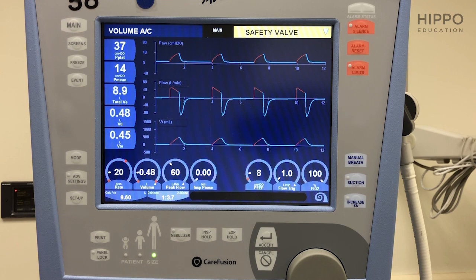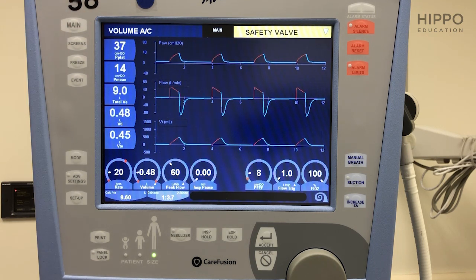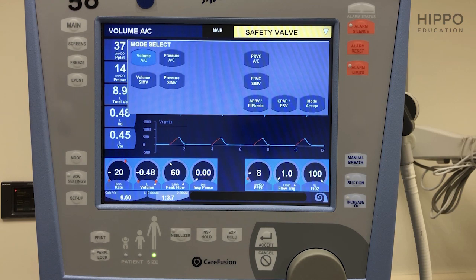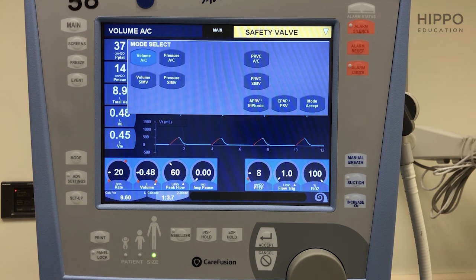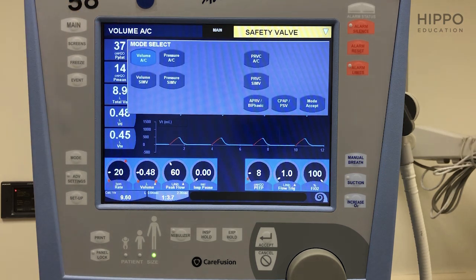The first thing you want to do is make sure you're in your volume assist control mode. You can see here at the top it says volume assist control, so you're good. But let's say it wasn't there — all you'd want to do is go down to mode, press it, and these are all the different modes on the ventilator you can choose from: pressure assist control, volume SIMV, etc. Keep it simple — volume assist control, which is the default in this ventilator.